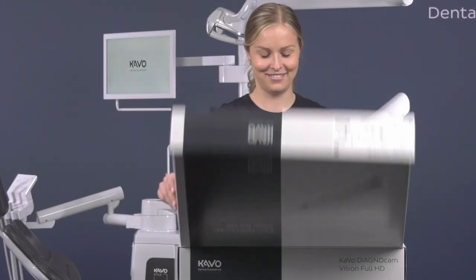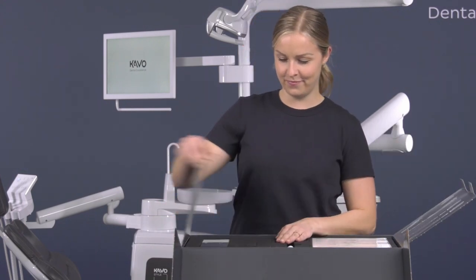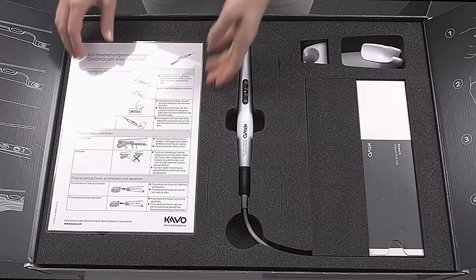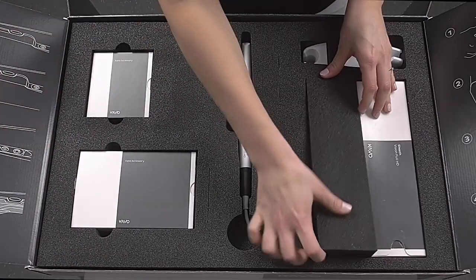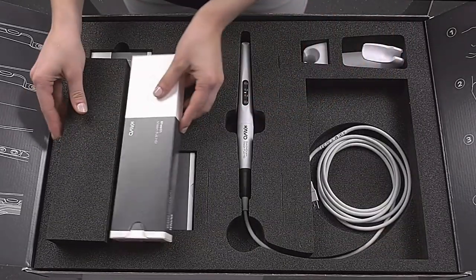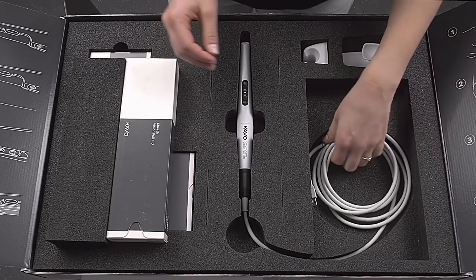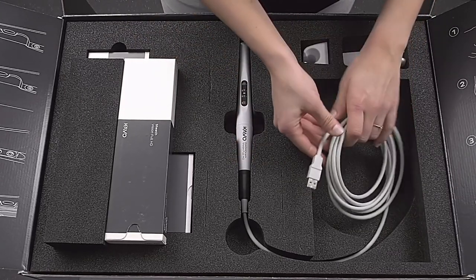The Diagnocam Vision Full HD is available with two different cable lengths — either as a standalone device with a cable length of 2.5 meters, or integrated in your treatment unit with a cable length of 1.5 meters. The camera has a USB connector that can either be plugged in directly into your unit or into your computer, and is USB 2 and 3 compatible.